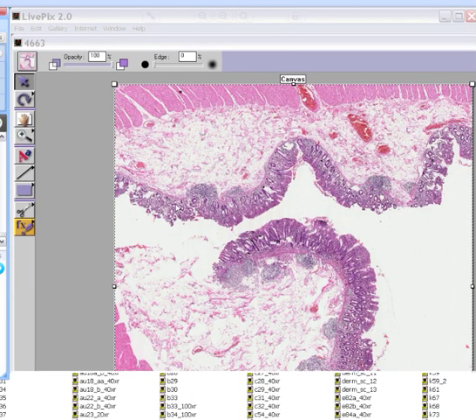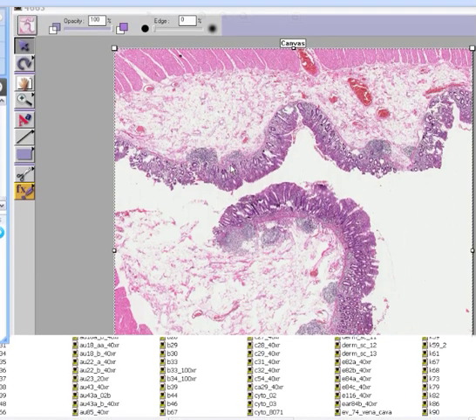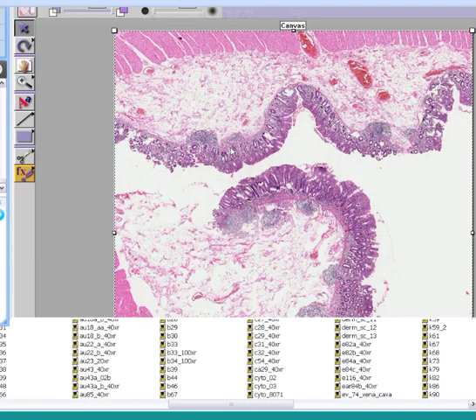And you can see the mucosa, and it's in a wavy sort of pattern. And so just from the fact that you see something like this, you know it can't be esophagus, and it can't be small bowel either, because there is not a villus pattern. And the person who just said large bowel is correct. This is a classical colon.